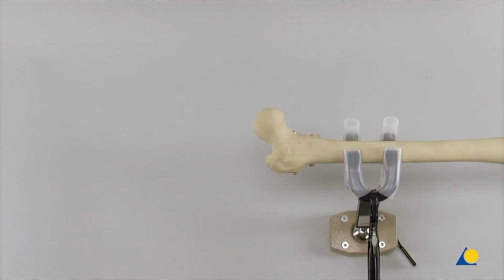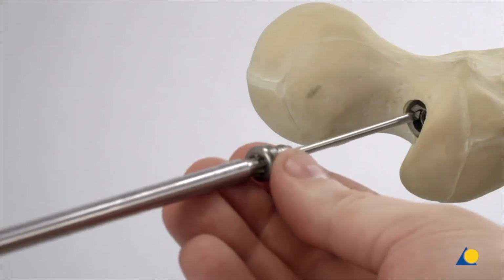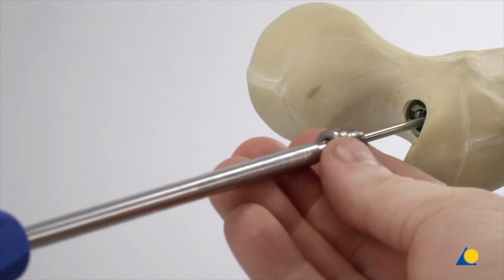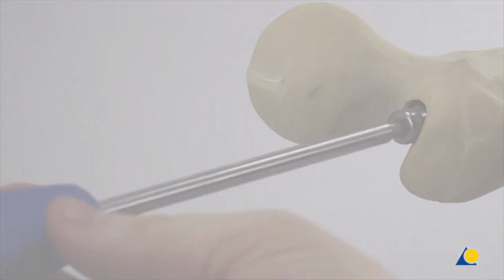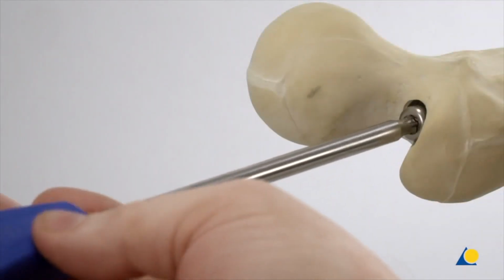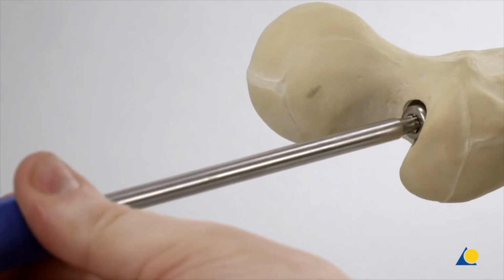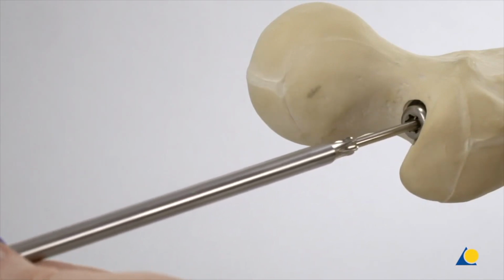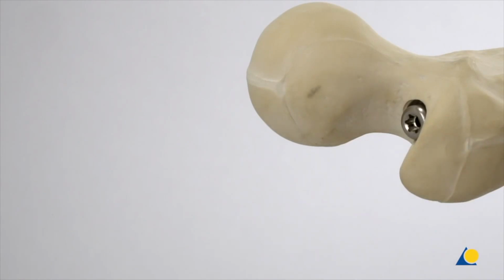The guide wire is inserted into the cannulated screwdriver star drive T40, followed by the 5 mm end cap. The guide wire is inserted into the nail recess. The screwdriver is turned clockwise to the stop to insert the end cap. In the clinical situation, freehand distal locking would occur at this stage of the procedure. However, distal locking is not demonstrated here, as the focus of this presentation is the antegrade femoral nailing at the proximal end.